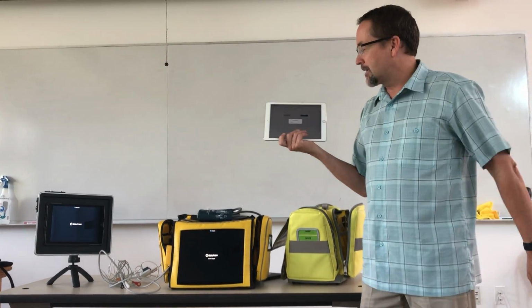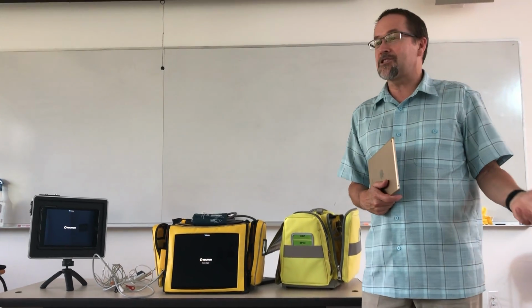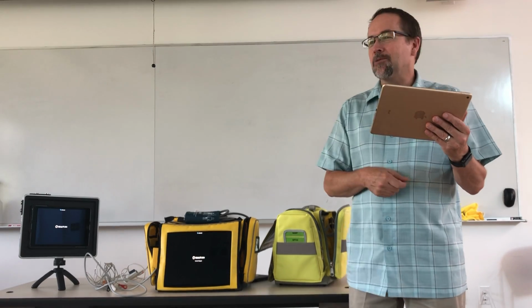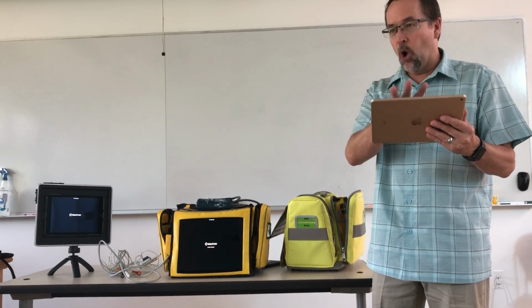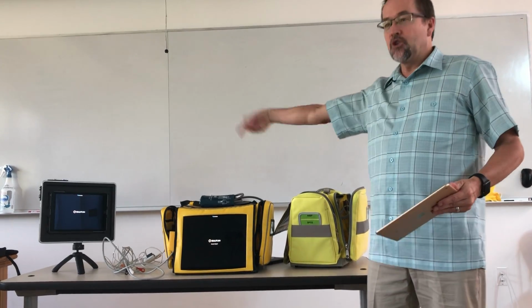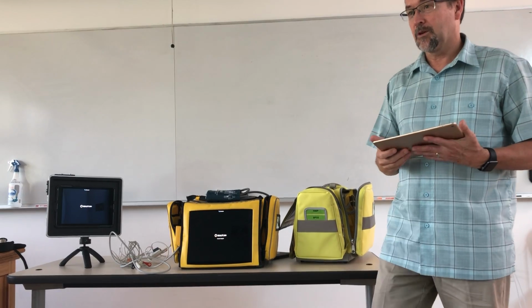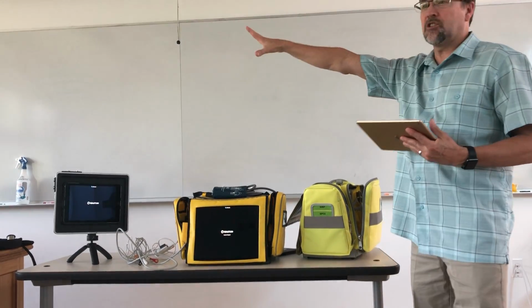Now your students are connected to it, and what it pulls up is that same voting choices I just showed you and a comment field. So you could have 4 students standing in the back or 6 students standing in the back watching the scenario going, oh, good teamwork, poor communication, or I don't like what he did here. They can add comments, and the only place they show up is on your facilitator iPad. So they're looking at the facilitator screen. No, they don't see, they're watching the scenario.